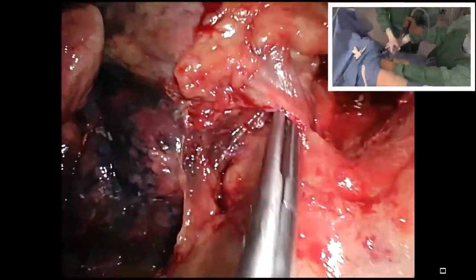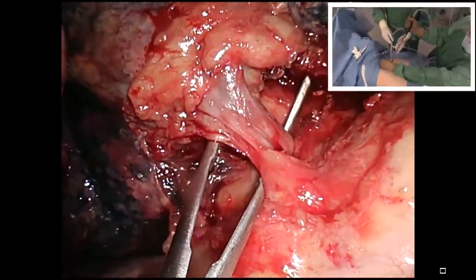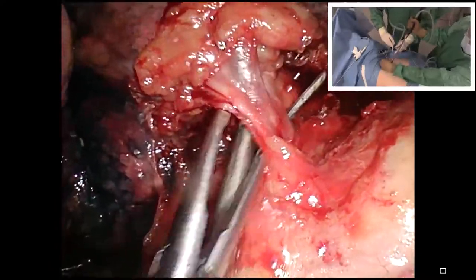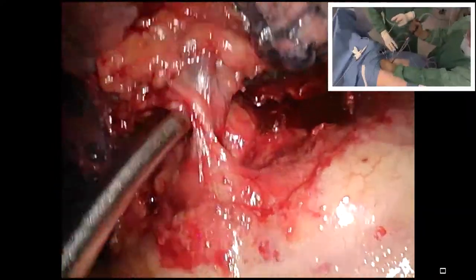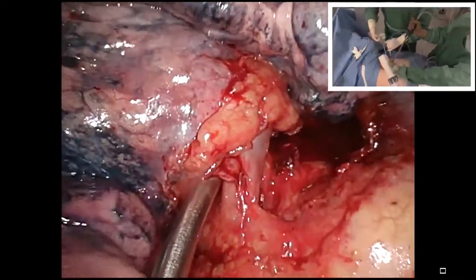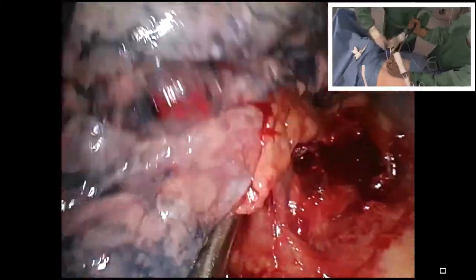So, it was important. And now I show you the trick of the sucker, which is to do like this. You put the sucker down now. Like this? Yes. You will see. We remove it, and now we lift up. This, we rotate. Like this.